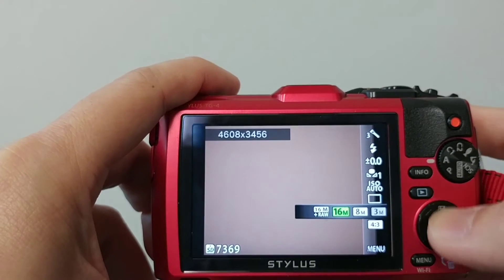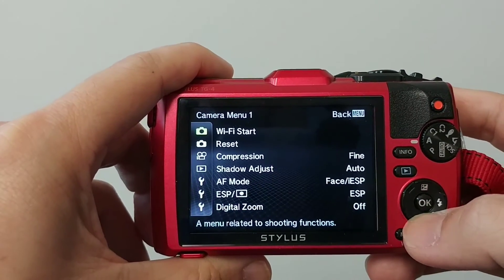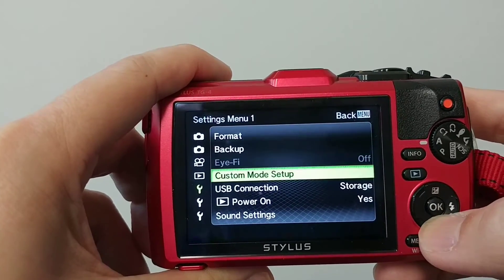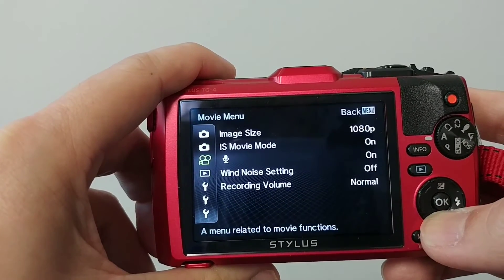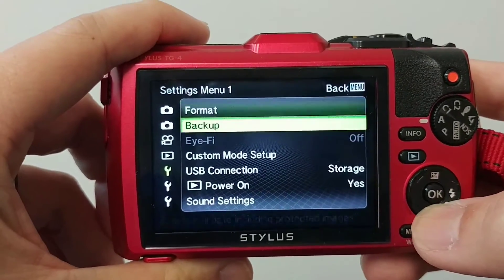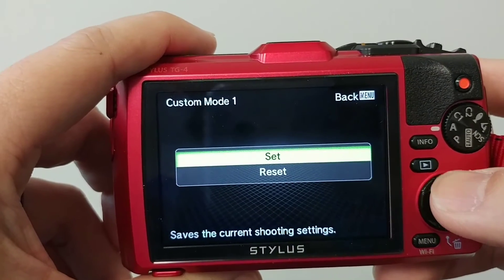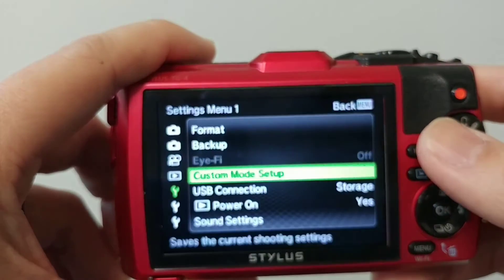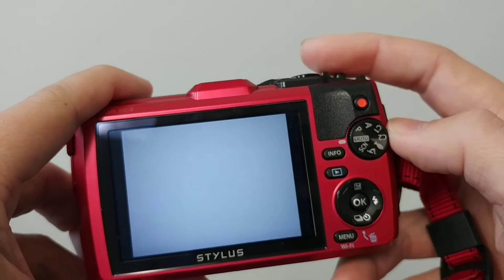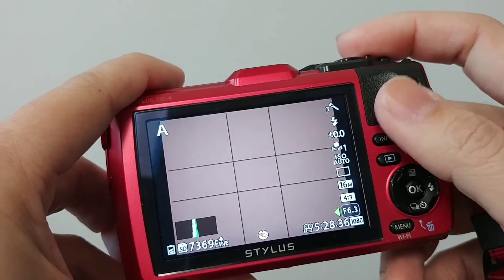I leave ISO on auto and hit okay to confirm. Then I go to the custom mode setup under the first monkey wrench menu, go to custom mode setup, hit okay, then select custom mode one. It asks if you want to set or reset — I hit set, and that saves all those parameters. I tell my staff to use auto mode for headshots, and when we have dental shots we turn to C1 mode, which has all those saved settings.